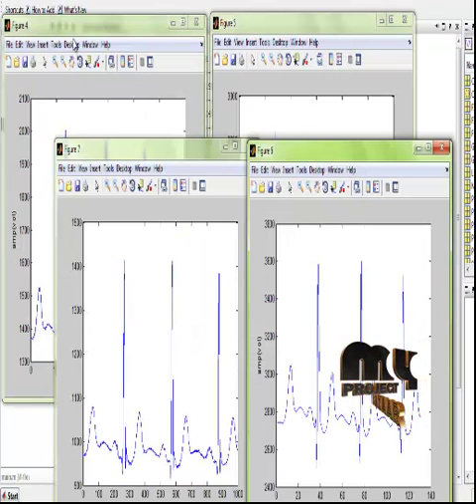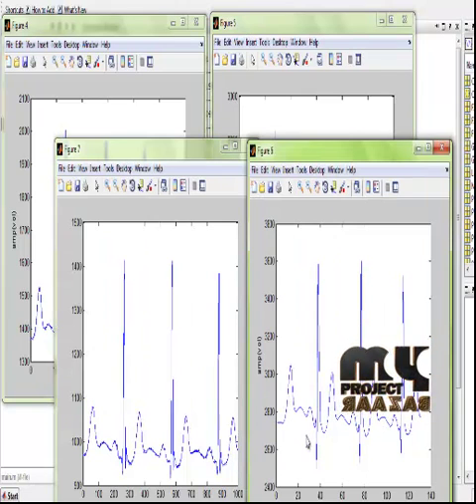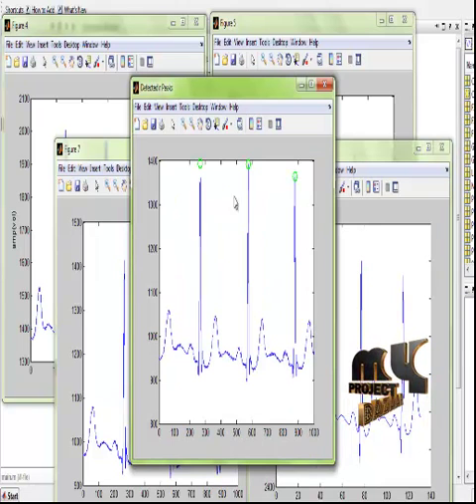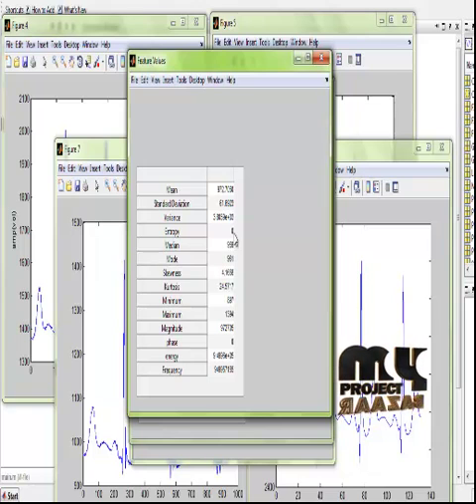After this selection of the particular segment, the selected coefficient has been further divided into these four coefficients based on the wavelet transformation process. After that, the R peaks in the ECG signal are calculated. These are all the detected R peak values in the ECG. This is the feature values extracted from the input signal.